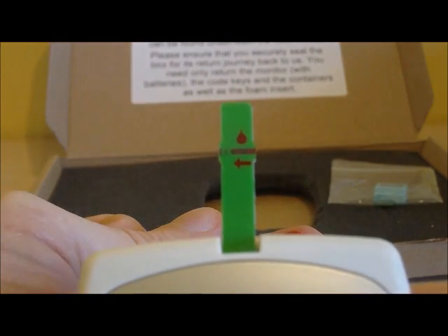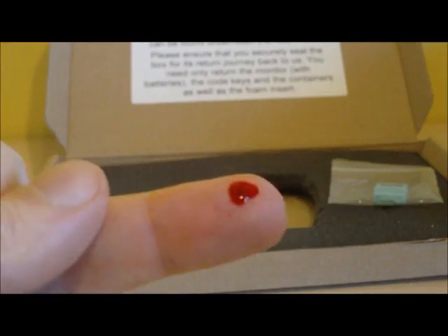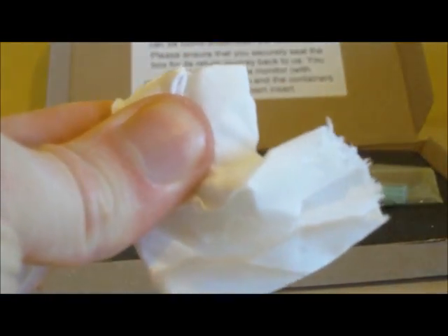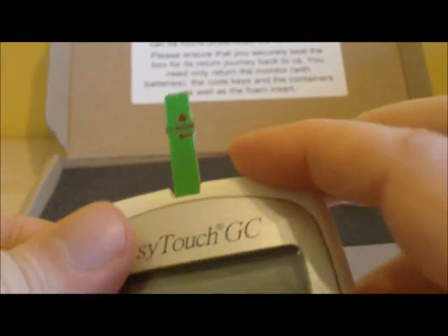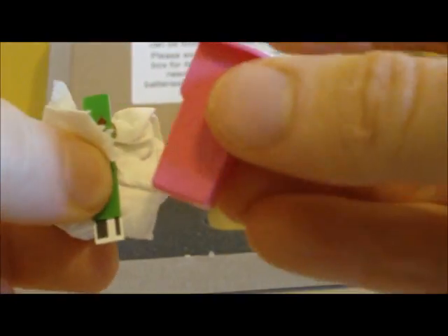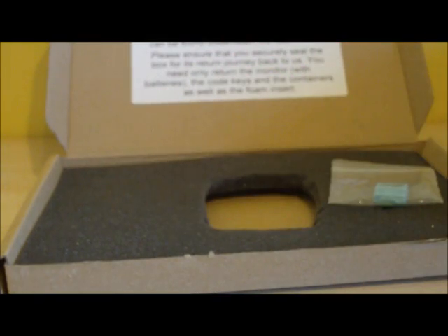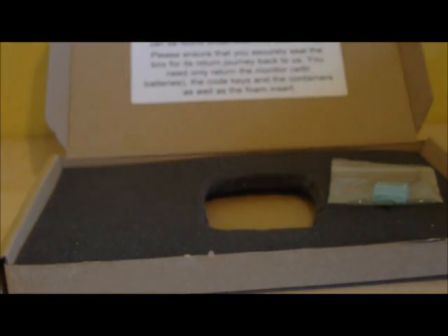Put your monitor to one side, grab a piece of tissue and hold it down on your finger firmly. Remember to discard your test strip — remove it from the monitor together with your piece of tissue and the used lancet, and throw them all away. You can then write down your result on your results card against fasting glucose. In this case the result was 5.7.